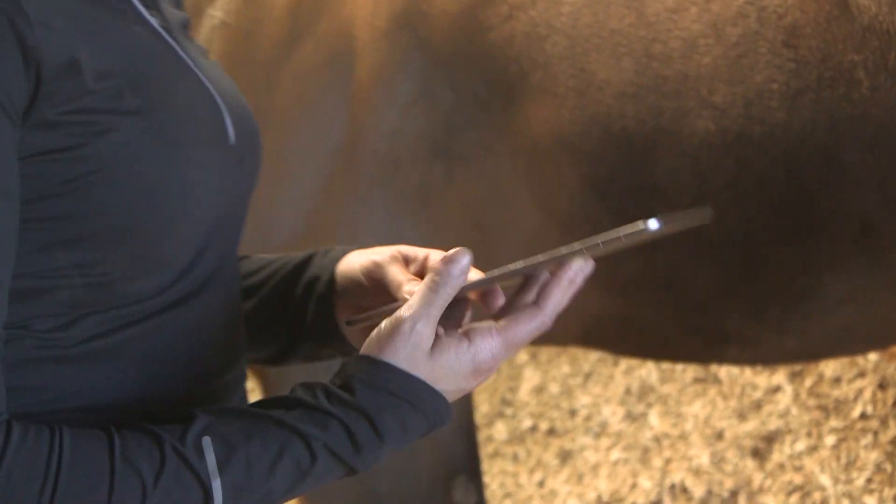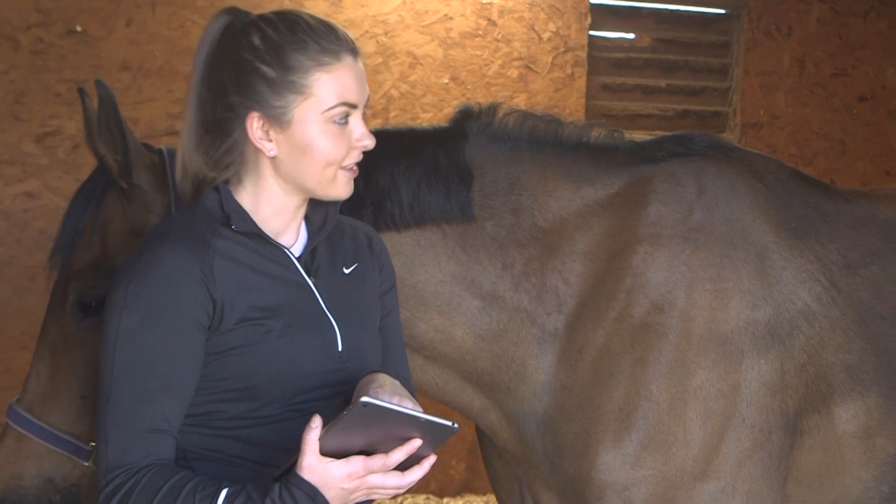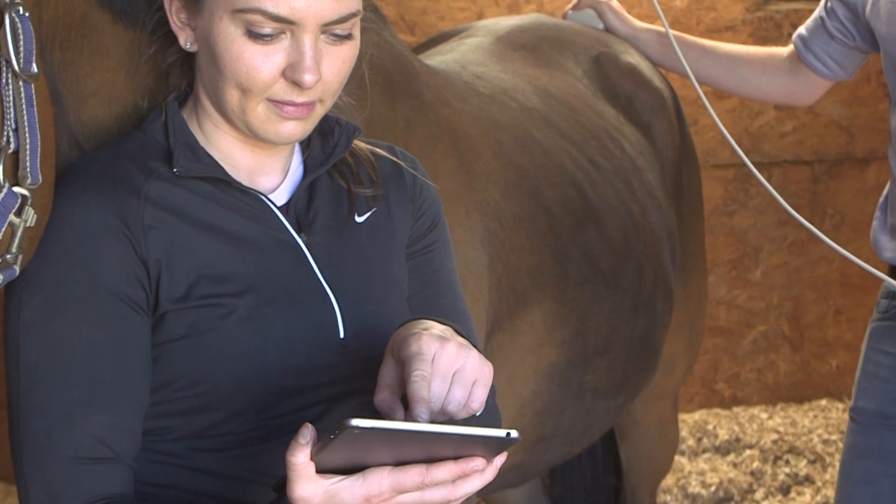The image can also be shared live with your client using the innovative EchoPad app. With remote control access, the live ultrasound can be streamed to an iPad, allowing remote viewing in real time.